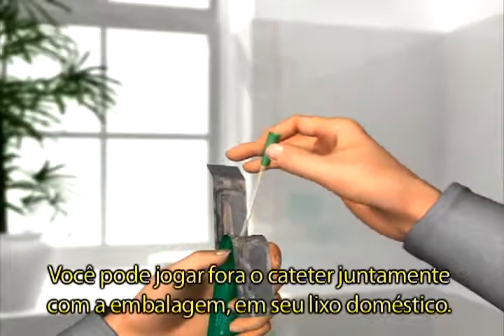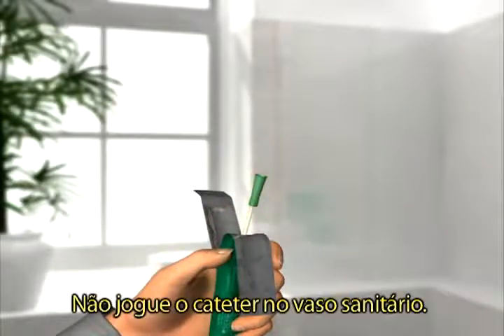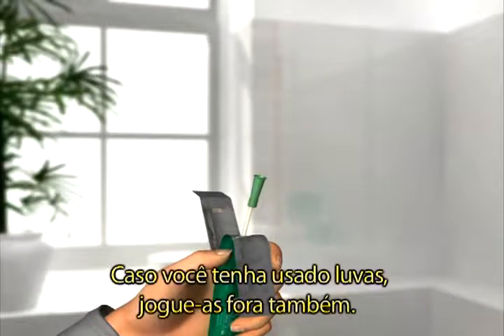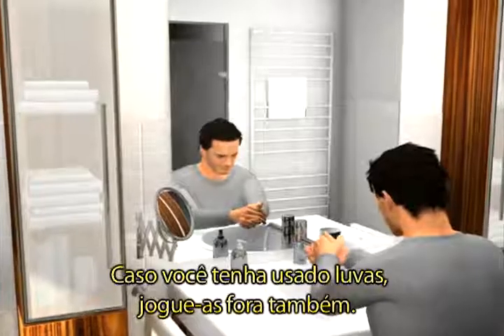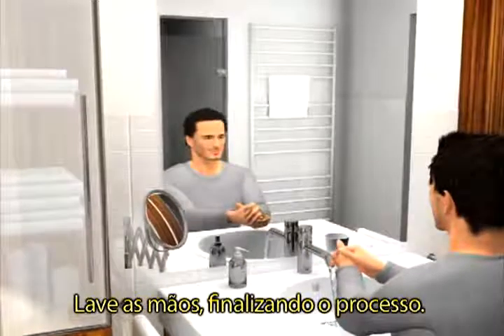You can dispose of your catheter and the packaging in your household rubbish. Do not flush it down the toilet. If you have used gloves, throw these away as well. Wash your hands and you have completed the process.